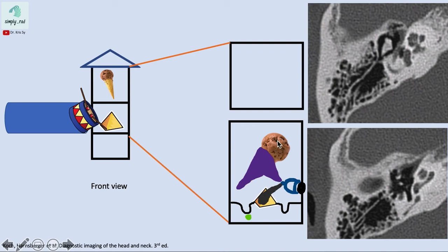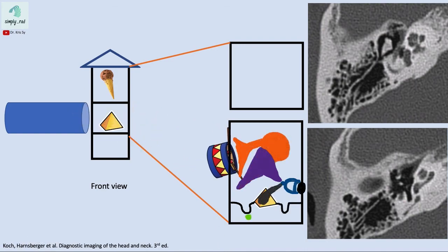The malleus articulates with the tympanic membrane via its handle — the manubrium. So the pathway is: tympanic membrane to malleus, malleus to incus via the incudomalleolar joint, then incus to stapes via the incudostapedial joint.